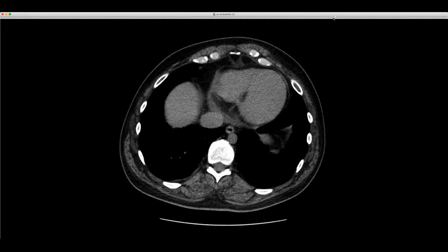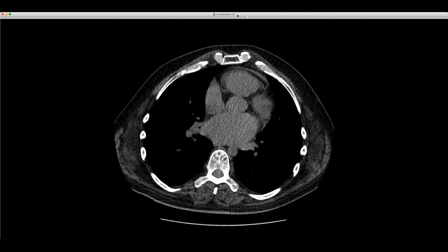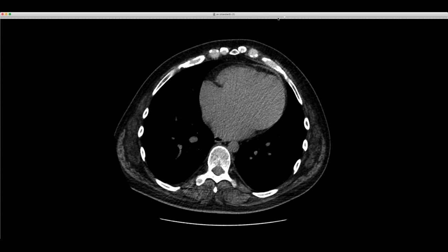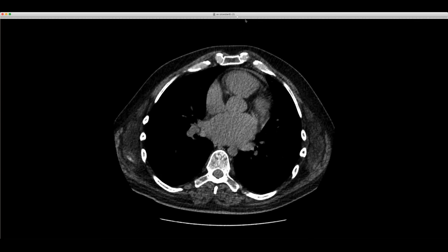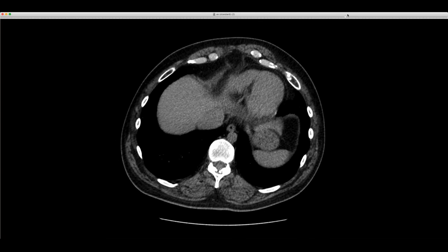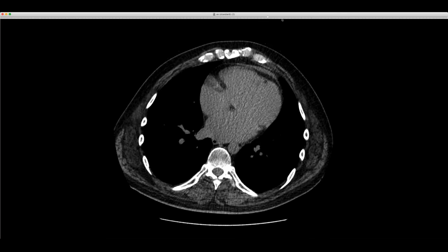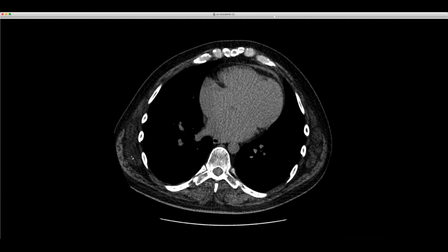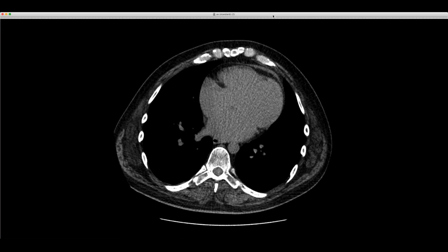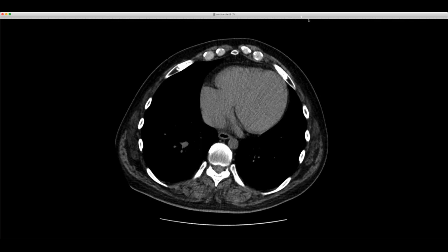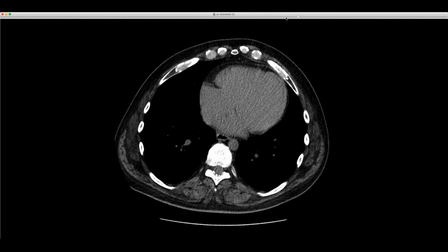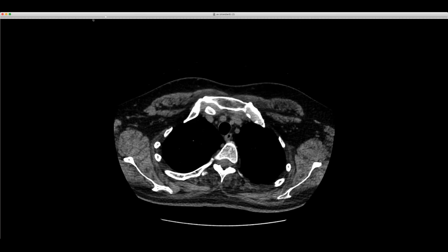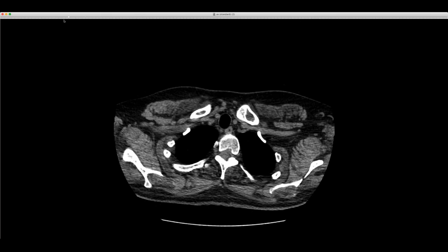You can tell the wall is very thin, the left ventricle is enlarged, and the left atrium is enlarged. This patient clinically has a low EF — around 30 to 40%. The other abnormal thing here is diffuse fatty atrophy of all the muscles of the thorax.